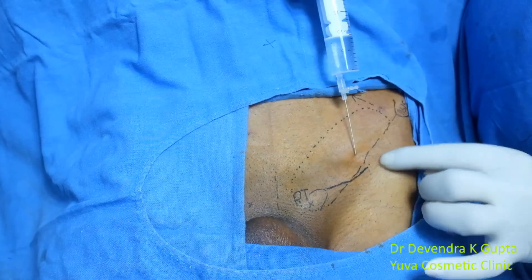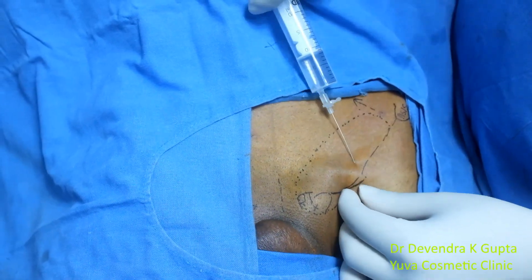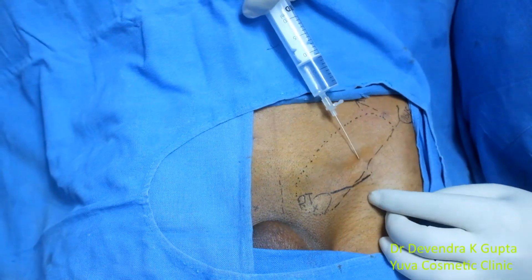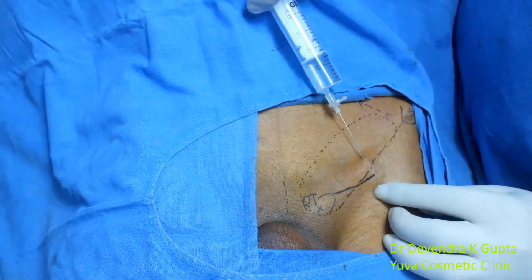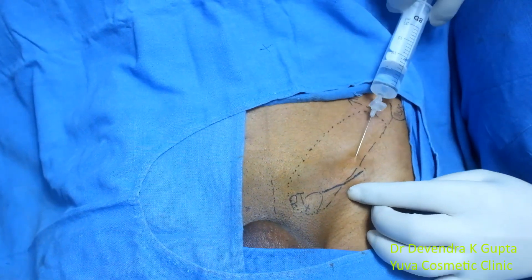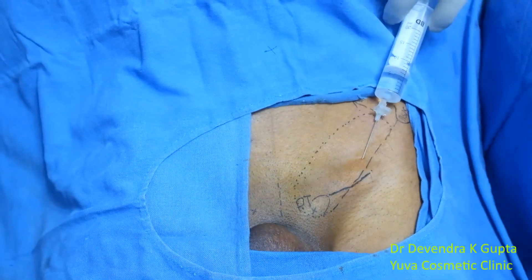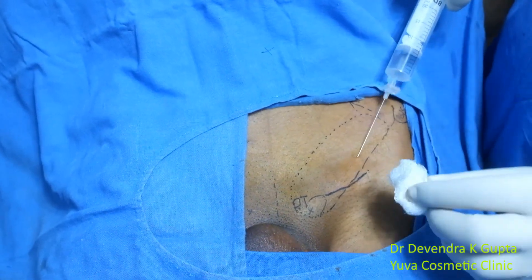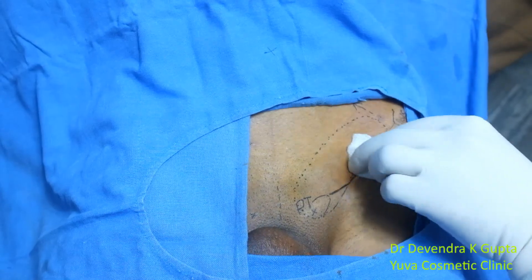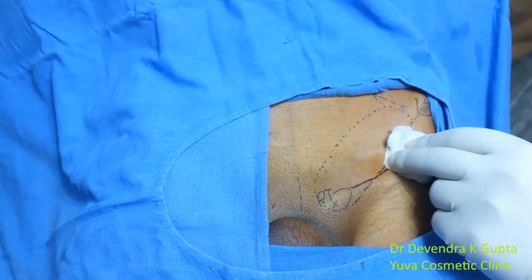Because this area is not yet anesthetized, just tilt the needle in a downward direction to block the extreme distal end of the incision. The tumescent solution minimizes bleeding, works like a physiological tourniquet, and at the same time also acts as post-operative analgesia.